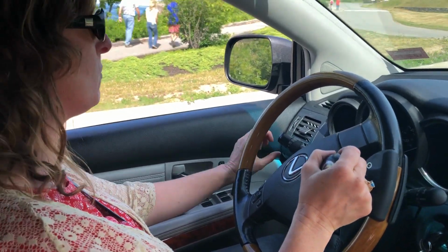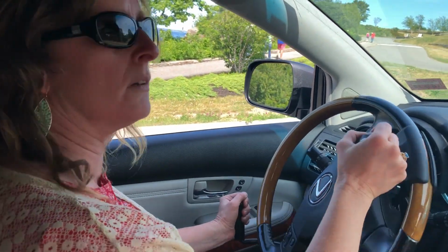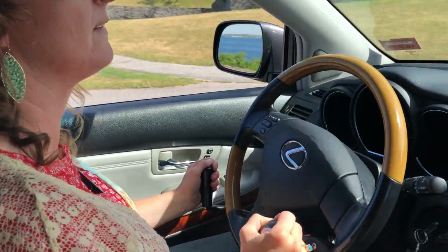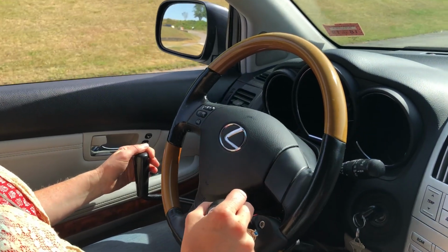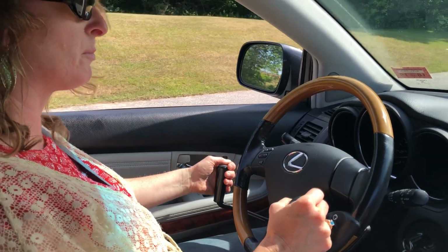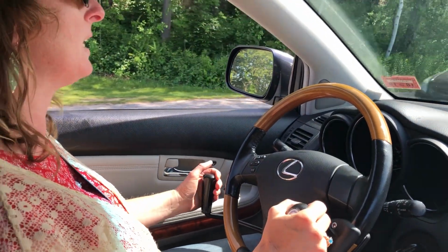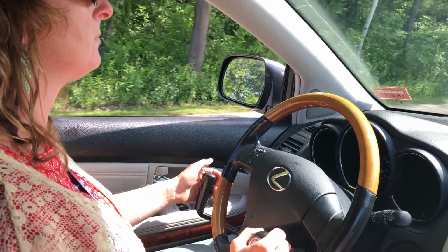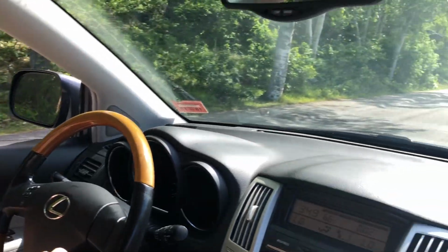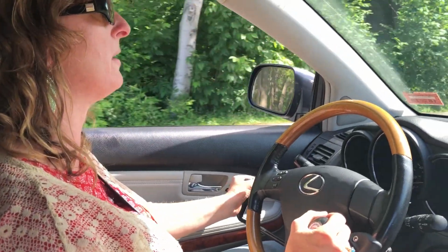So with these, you just kind of have to walk your hand up to get the blinkers. So the motions, when you're doing the gas, you need to make sure that you're bringing it towards you, because you can accidentally hit the brake and the gas at the same time. So when people are learning to use the hand controls, that's what we're really getting used to, is how you coordinate your hands with the equipment.